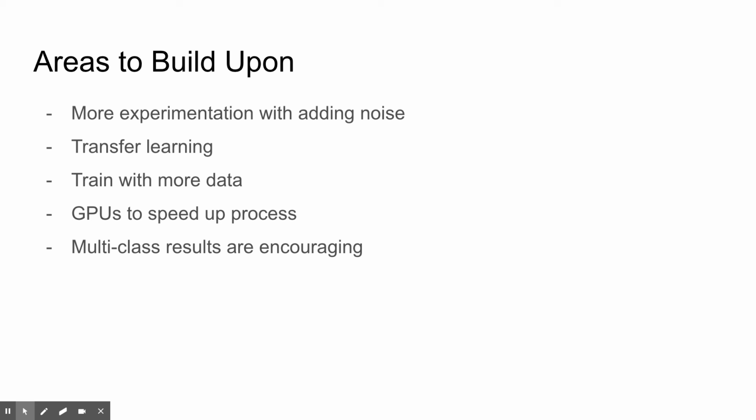The relatively small dataset makes it easier for the model to overfit as well, so gathering more data would be useful. The deeper model also has a longer runtime, which limited testing possible modifications in this iteration of the project. So future work should involve using GPUs. Overall, based on the results in the multi-class scenario, it seems like implementing these adjustments in the future could place DarkNet 53 as one of the gold standards in this space.